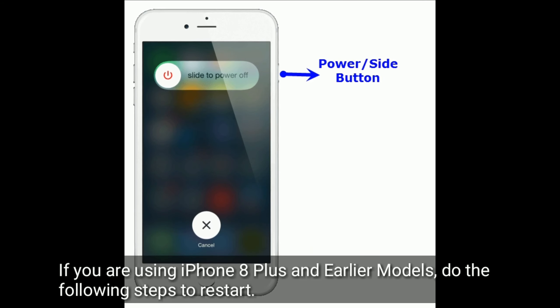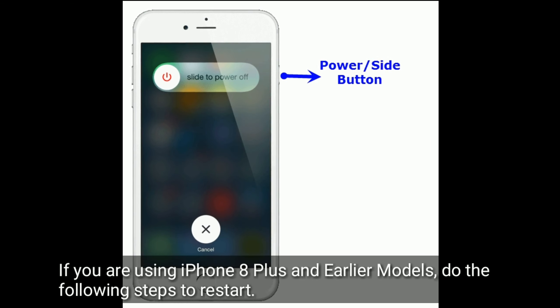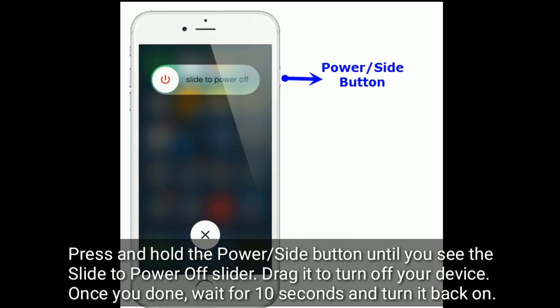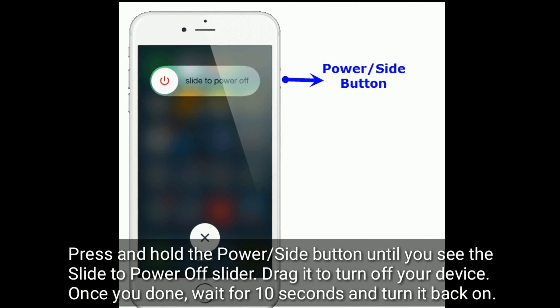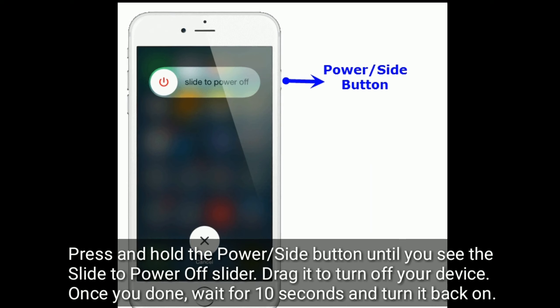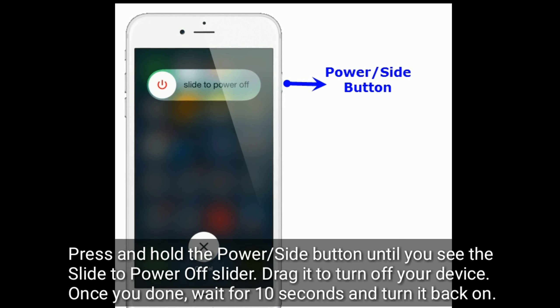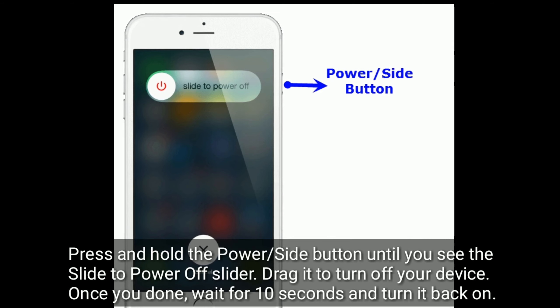If you are using iPhone 8 Plus and earlier models, do the following steps to restart. Press and hold the power or side button until you see the slide to power off slider, drag it to turn off your device. Once done, wait for 10 seconds and turn it back on.